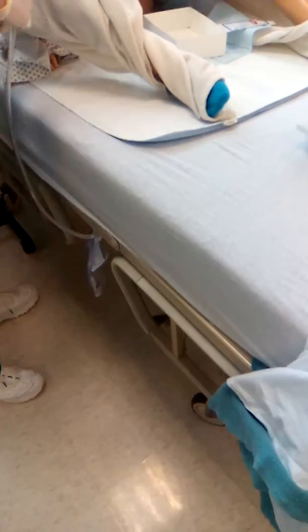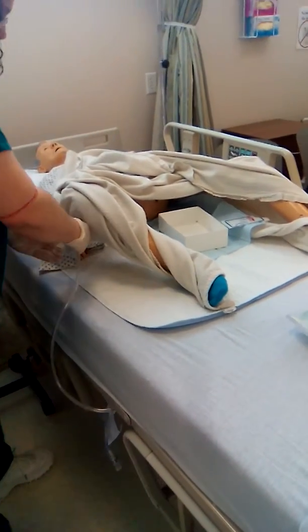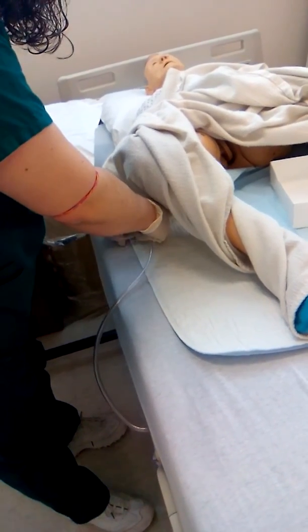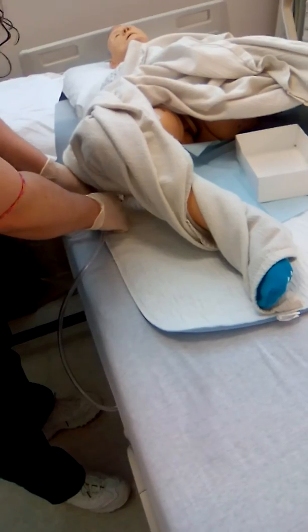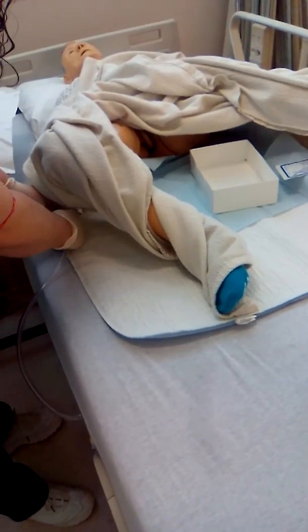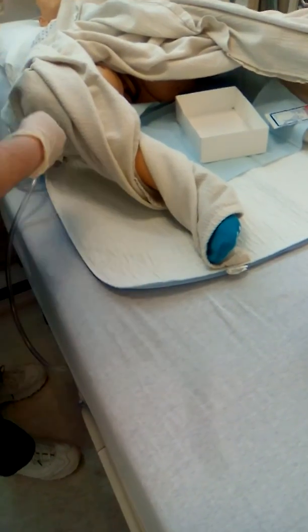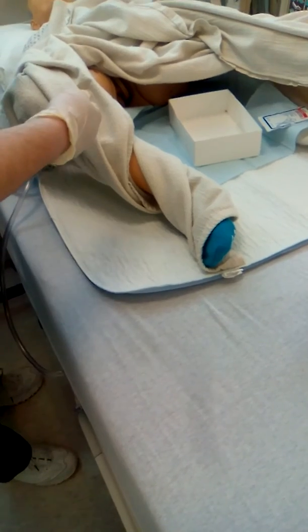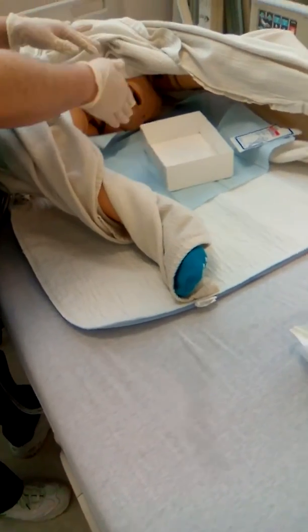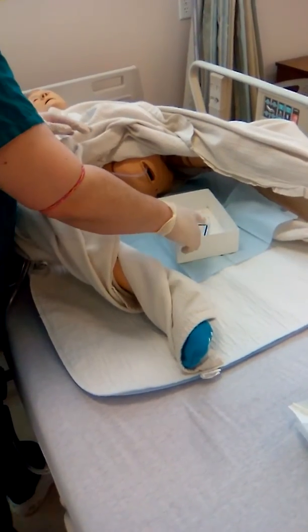I will coil my tubing and I will connect it to either the top sheet or the bottom sheet or the bed pad so that it doesn't get pulled when you reposition the patient. I will then provide hygiene as needed. I will dispose of my supplies.